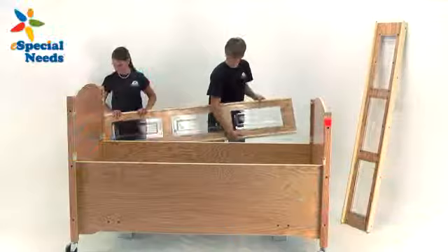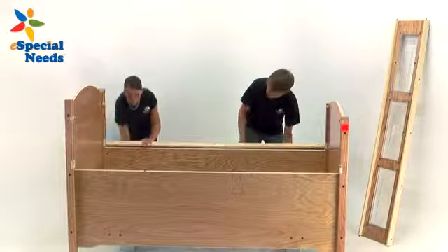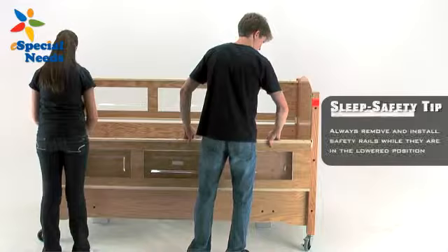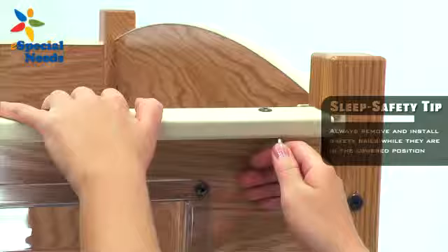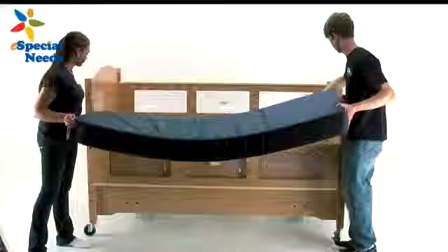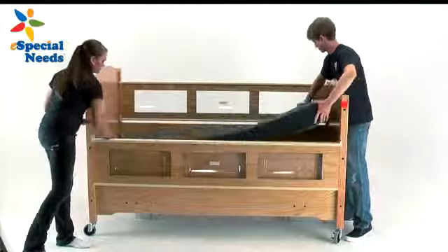Step 3. Install the safety rails, item number 5, by inserting the black hex bolt pivot pins into the lower plastic strikes installed on each leg as shown. The rails can then be tilted up into the locked position. The safety rails should be installed so that the clean side of the rails faces the occupant of the bed when closed. The screws should be visible from the outside. Be sure to always remove and install safety rails while they're in the lowered position. Always check to be sure that the brass pins are locked in place to prevent the safety rail from opening unintentionally.